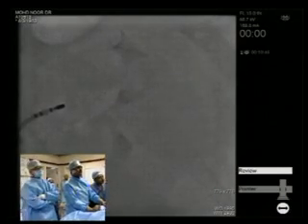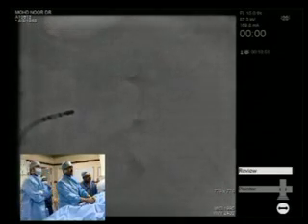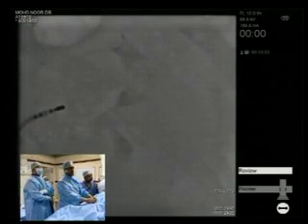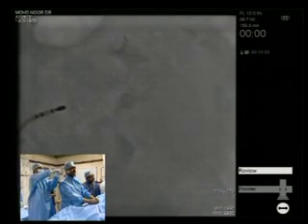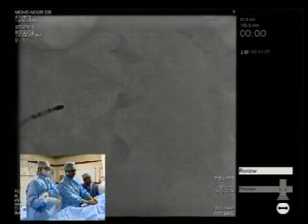And the third question is, you just mentioned that you torqued it so that it faces the posterior wall. How do you ensure that it is in the posterior wall? Once you torque for a left-sided curve, it touches the posterior wall and you can fluoroscopically validate it. The second thing is again the impedance. If you are not touching the wall, the impedance will change. Okay.